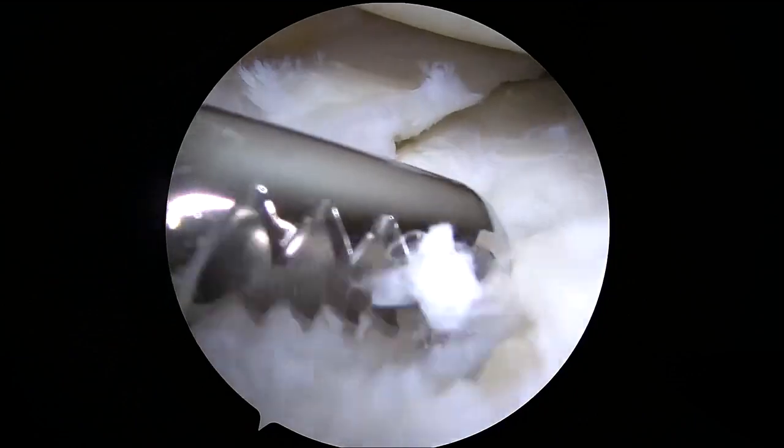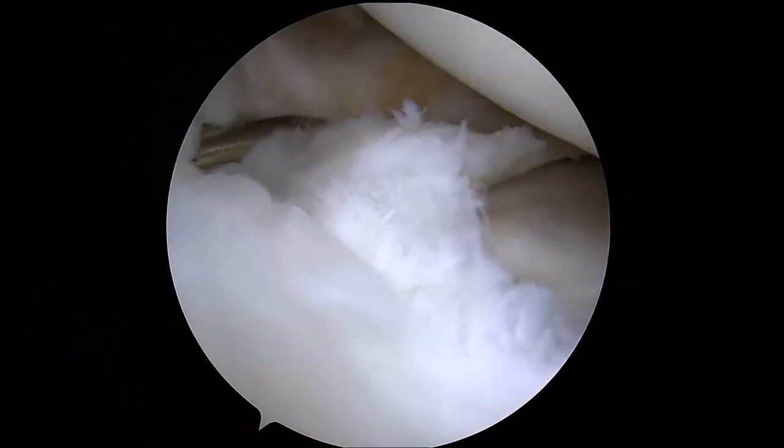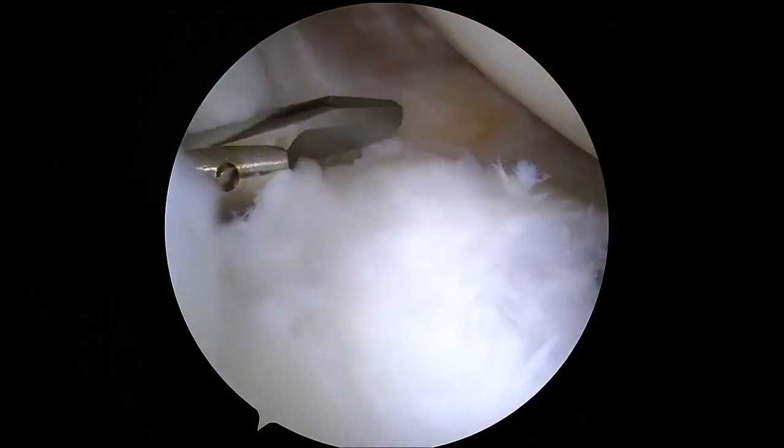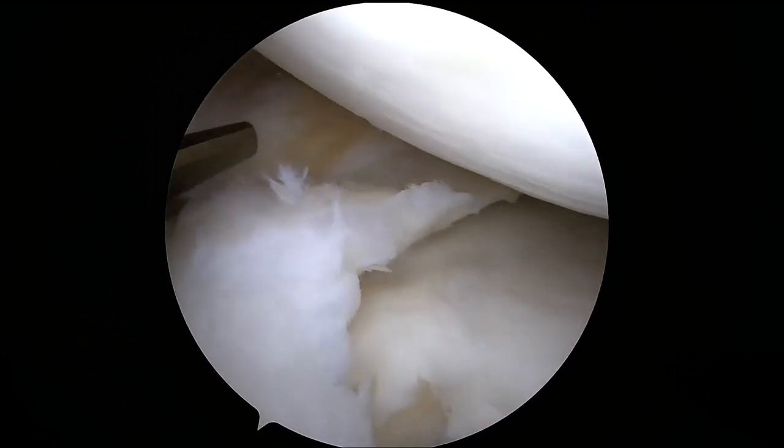The sutures from the previous repair are removed using a grasper and shaver. A scissor biter and shaver are then used to release the medial meniscus from about 60% of its capsular attachment until the meniscus can be pulled into anatomical position.